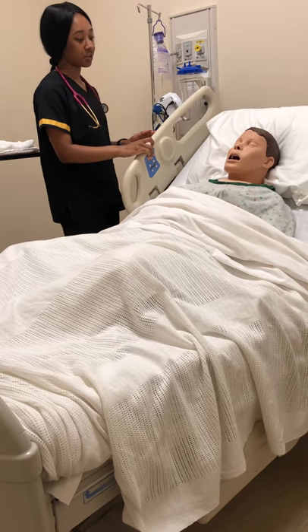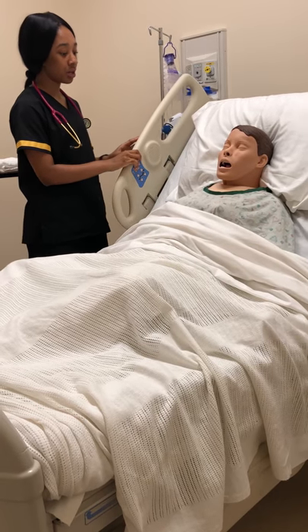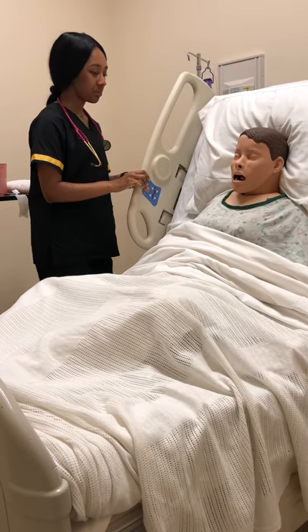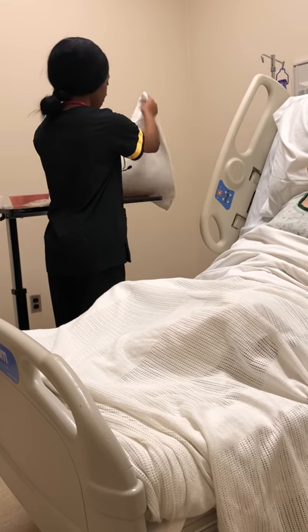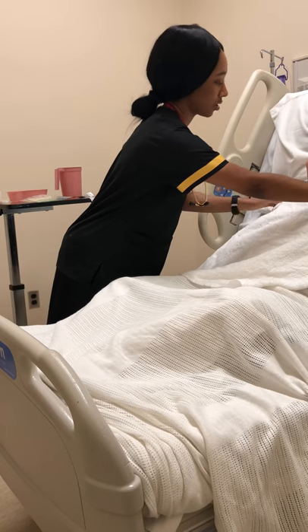So like I said, your doctor ordered you a nasogastric tube and it's just going to go into your nose and through your stomach, just so you can get your food properly because you've been having trouble swallowing recently. It shouldn't cause you too much pain or discomfort, but if you do experience any of that, just let me know and then I'll stop and we can start back up.